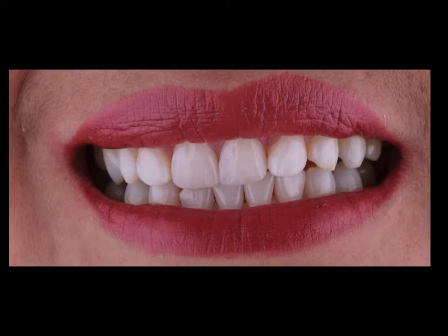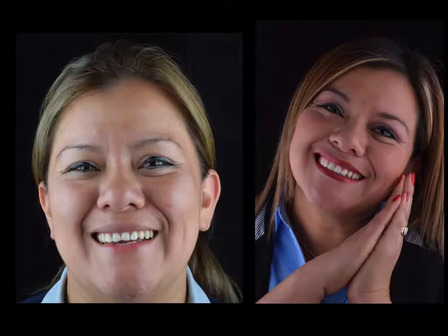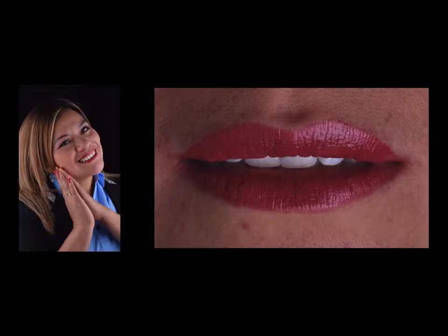Only two composite veneers on the two central incisors. Before and after. And as you can see, now she shows more of her teeth in a relaxed position.